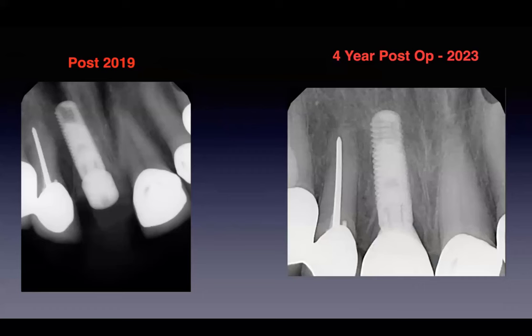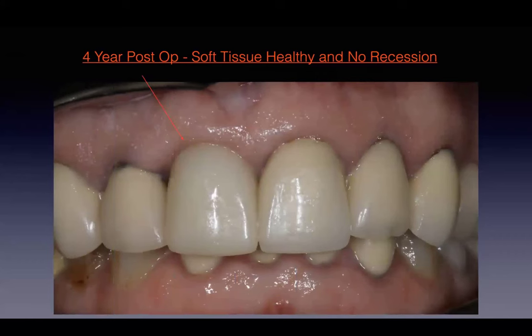So on the left, we got the immediate post-op and then a more recent 4-year post-op, and the soft tissue is still stable. No recession, no bone loss. It's a good technique to use.